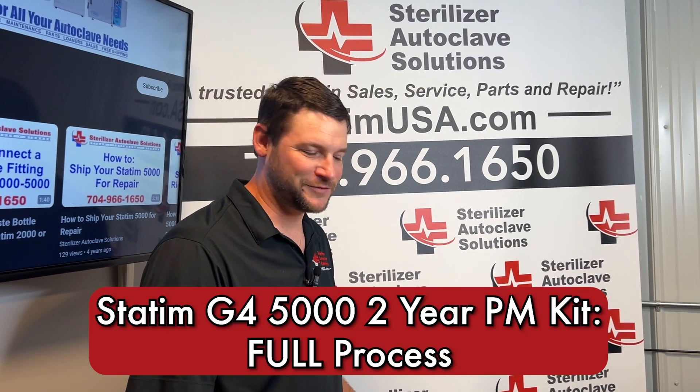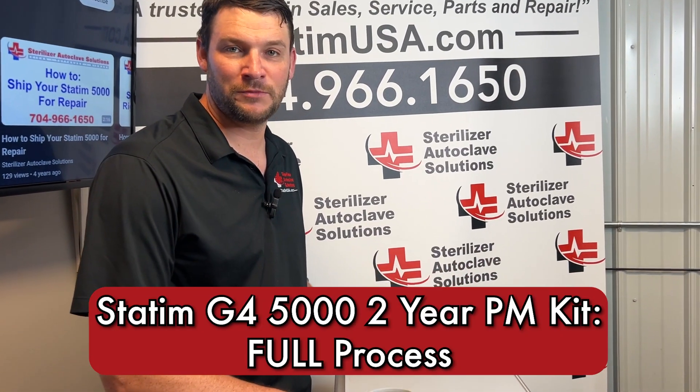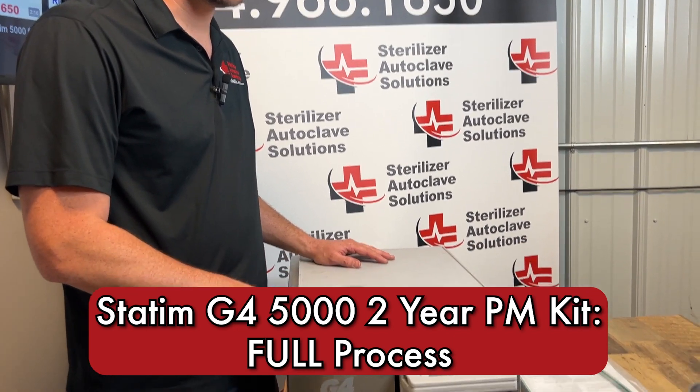Hi, this is Ian with Sterilizer Autoclave Solutions and today we are doing our two-year preventative maintenance on a Statim G4 5000.